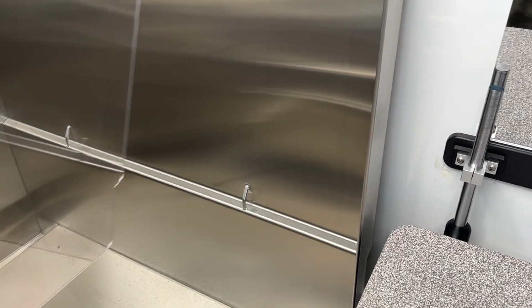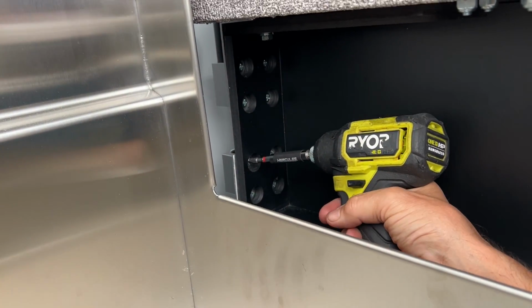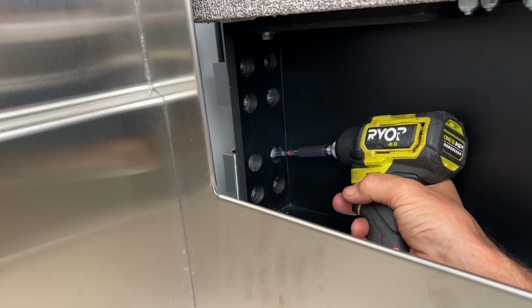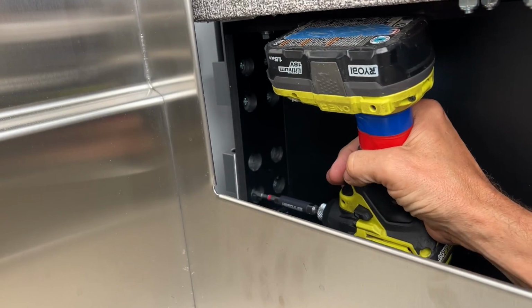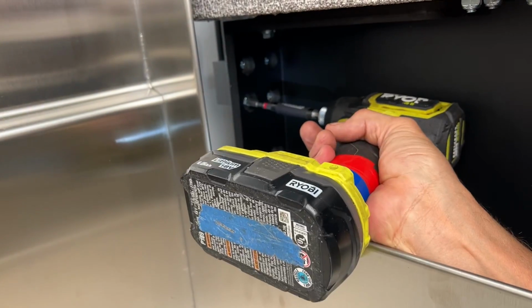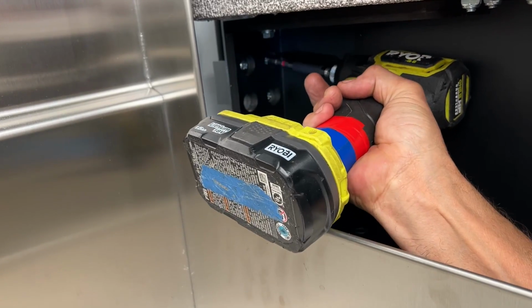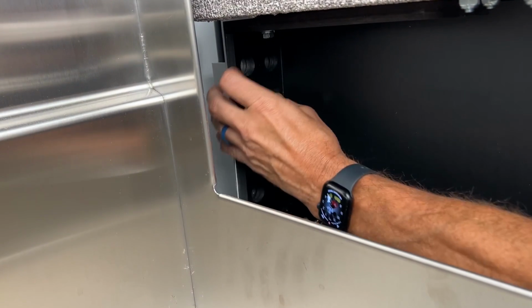Now let's remove the screws from the bearings. First, remove the clear Lexan splash guard from the tub for easier access to the screws. As you can see, I am using a drill or a driver to remove the screws, but I would highly recommend not using it for putting the screws back in later, which I'll talk about later. Now make sure you accumulate all the screws and washers in a container or set them in a safe place as you take them out.